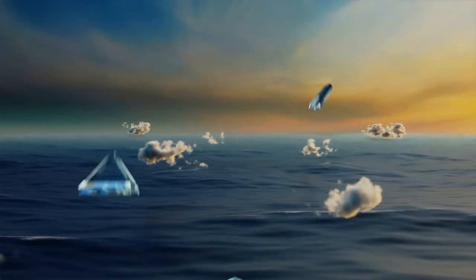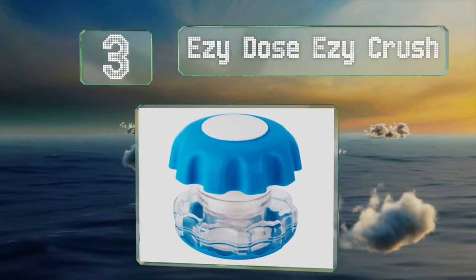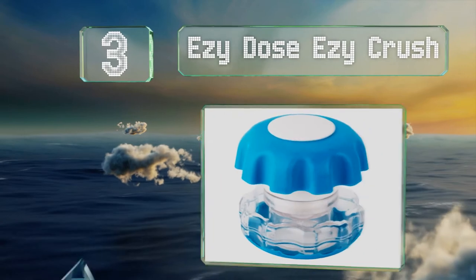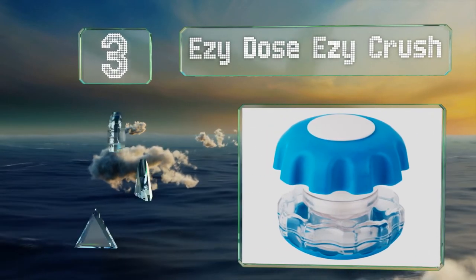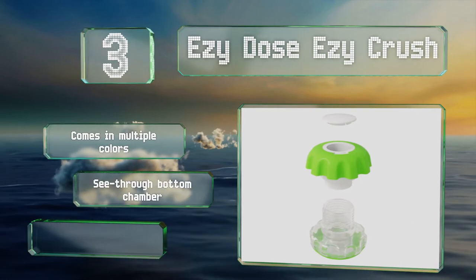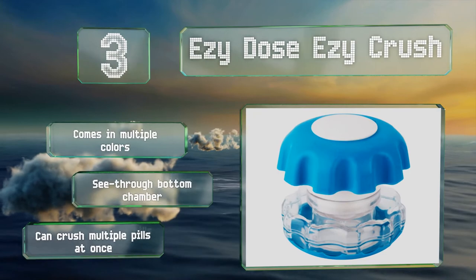Nearing the top of our list at number 3, the Easy Dose Easy Crush has an ergonomic top that helps you maintain your grip on it. It's small enough to be used for travel and the storage compartment holds about 4 pills. It comes in multiple colors with a see-through bottom chamber and can crush multiple pills at once.